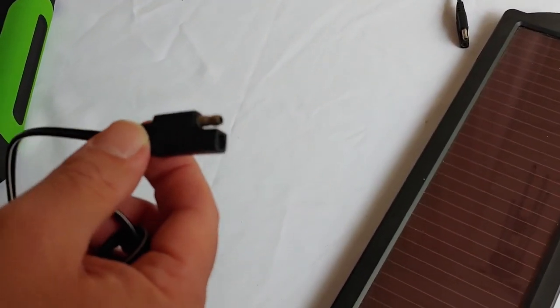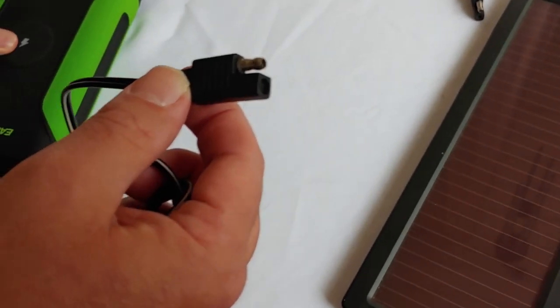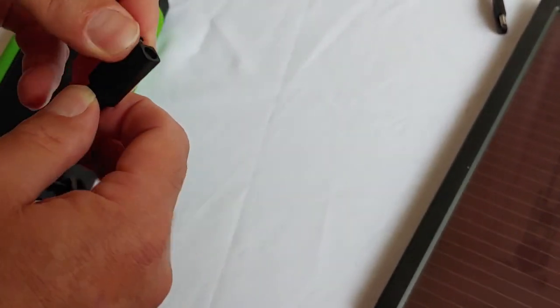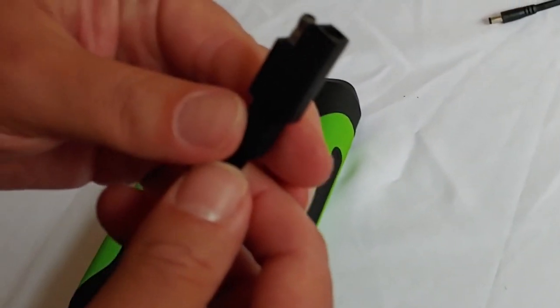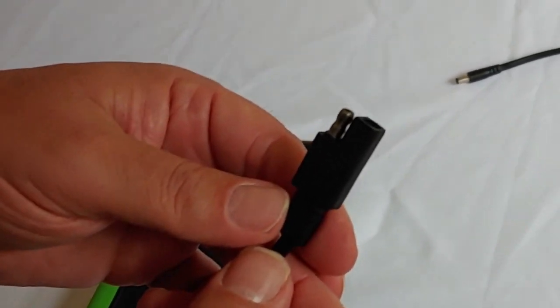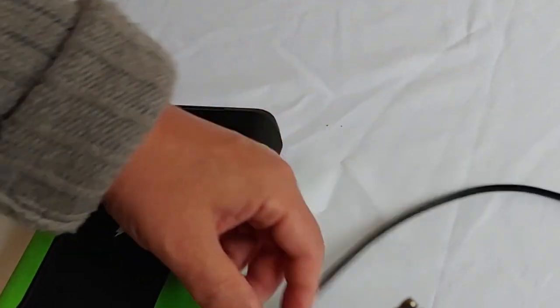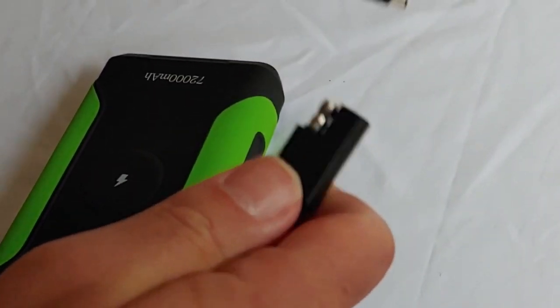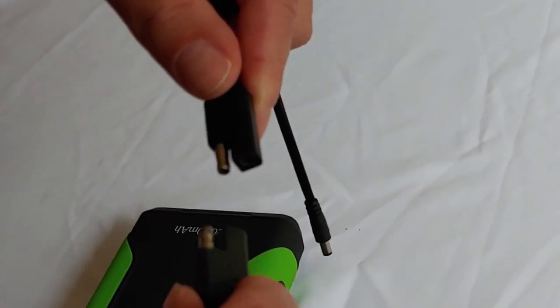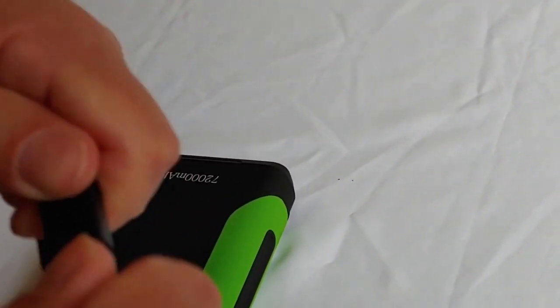This is a Harbor Freight solar panel, so it has a standard Harbor Freight connection right there. Most of what I use for small projects are Harbor Freight products, or at least their solar panels, because I think they work really well. Any Harbor Freight solar panel will work for this. What you need to do is get a connection that will connect to both. This connector connects to the solar panel — you can just plug it in right there, nice and easy, and it works.